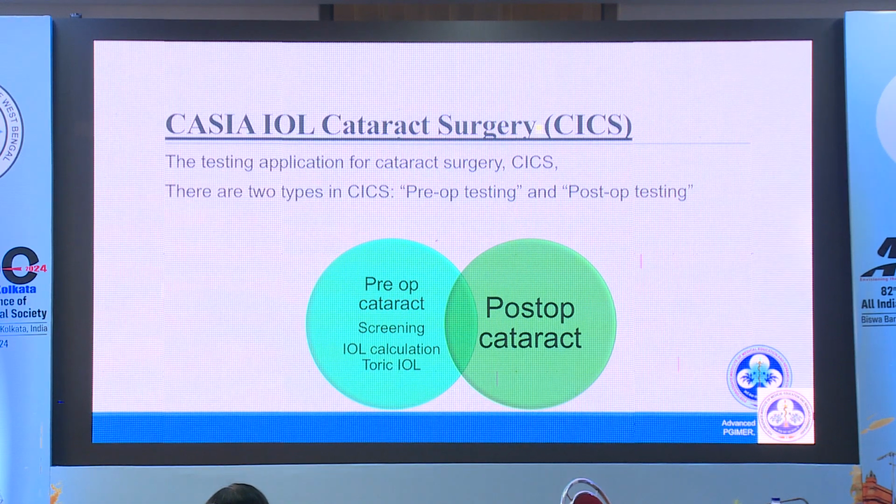To summarize, I'll just finish here. The CASIA has the IOL cataract surgery. Frankly, Dr. Rushad has spoken about it. We've not been using it for that purpose. It doesn't yet measure axial length, so it's not a complete biometer in that sense, and we haven't been looking at it from the point of view of managing the power in cataract surgery patients.